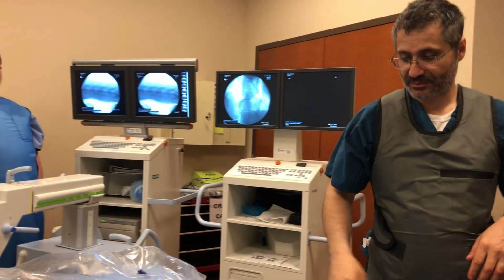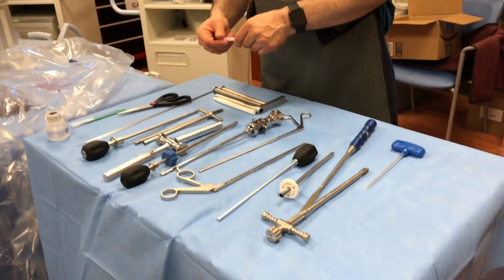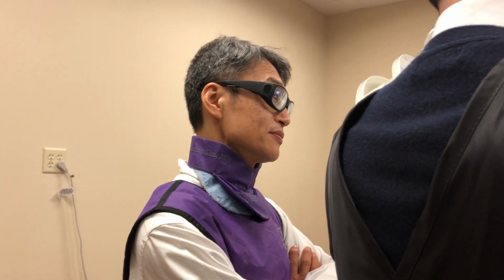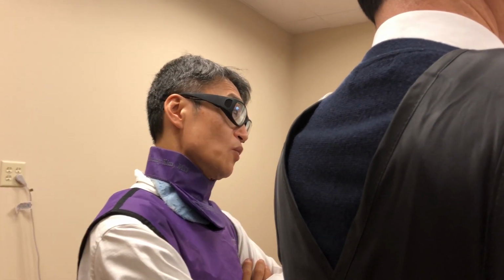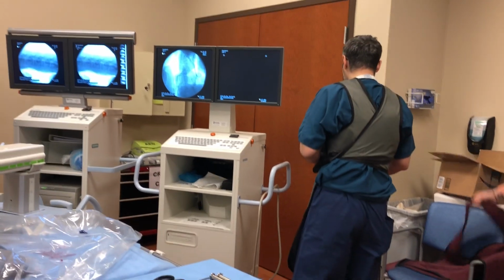Don't you think lower end plate is more important than upper end plate? I think getting a sharp image of the lower end plate. Yeah, but most of the time, when you get one, you get the other. But if you've got a scoliosis, if it's twisted at that level, I think lower end plate is important to get in sharp definition. Sure, yeah, absolutely. Lower end plate.